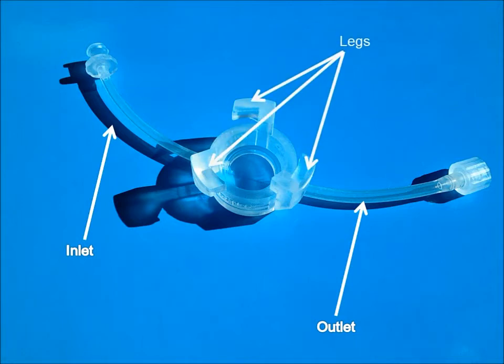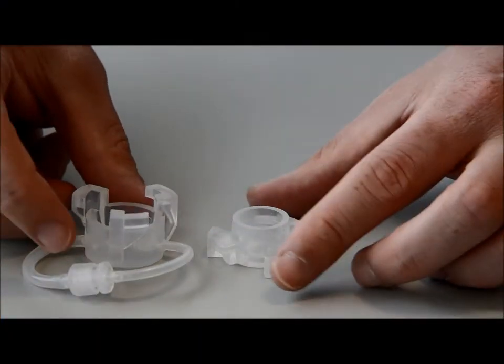The three legs of the lid correspond with the locking fins of the base around the upper inner lid circumference is a bead designed to compress when the chambers are closed and provide further leak proof sealing.